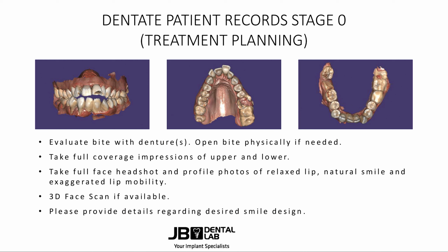If you've opened them to an increased vertical, please take this scan at the opened desired vertical. Next, you'll take full face photos from the profile and portrait with a relaxed lip, natural smile, and exaggerated smile. Take a 3D face scan if you have it as well, and give us any details necessary for the smile design.